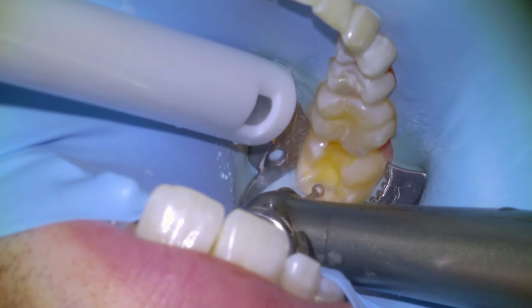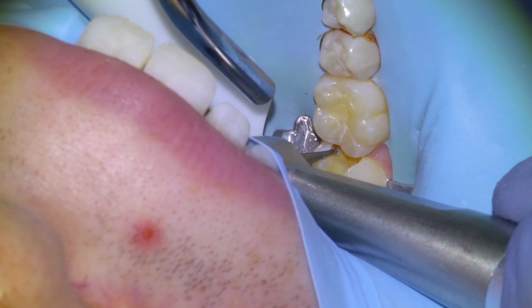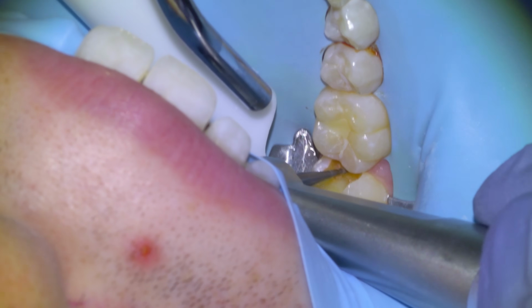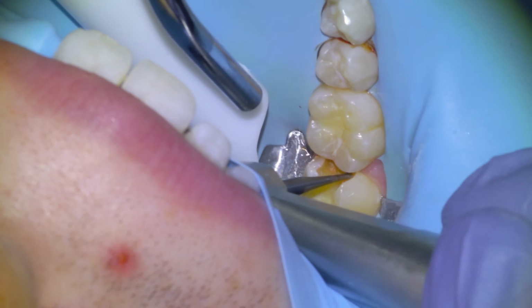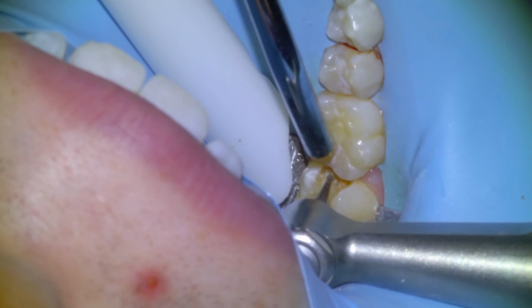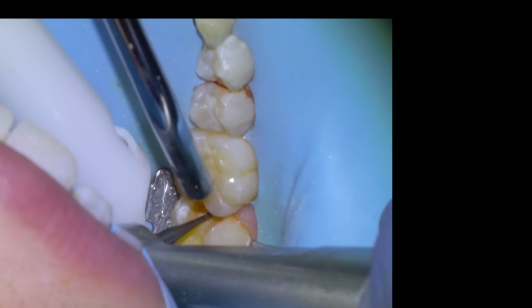Going to dry the tooth and still see a little bit of composite, so we'll remove it with a large round diamond, and now we have all of the old composite out, and we're going to begin our caries removal with a small slow speed carbide. This is my burr of choice for caries excavation because you just don't have to press as hard.